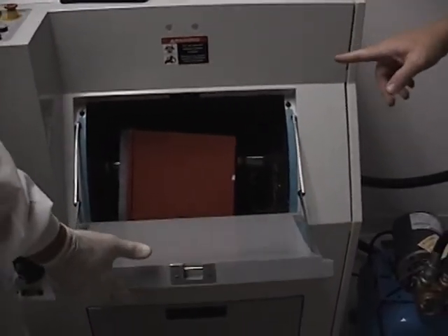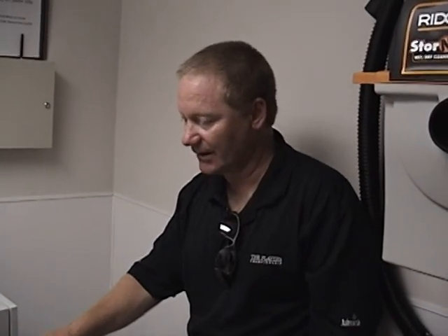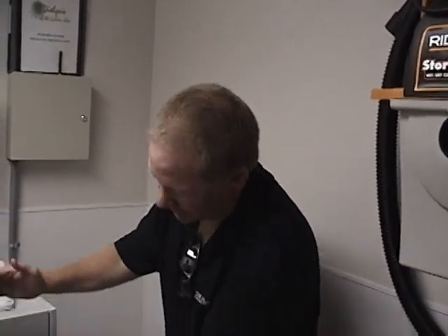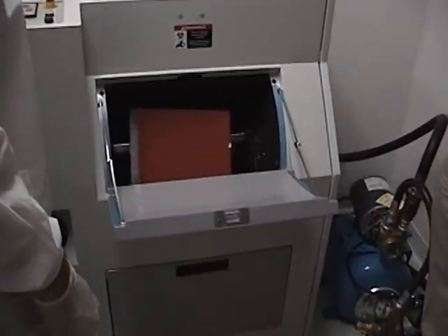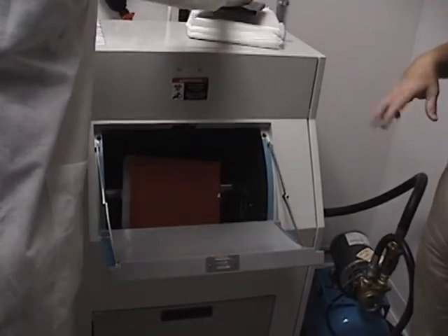A couple things before you run that load. This machine will only accept one sharps container — it's got to be two gallon, preferably the ones that we sell. Only because those are the only ones we found that fit and that the blades will catch. There's a press on top so when he closes that door, the chamber rotates up into the horizontal position and the press pushes it down — that's how those blades start to claw at that plastic as they circulate and grab.